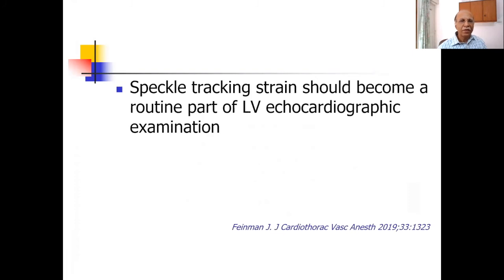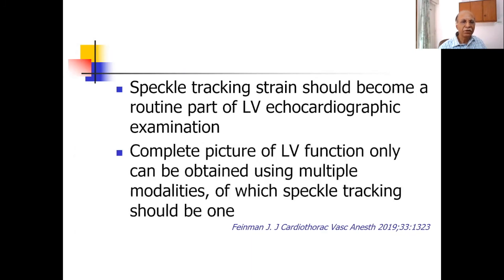Let's move on to the speckle tracking of the strain, which should become a routine part of the LV echocardiographic examination. It is suggested that a complete picture of LV function can only be obtained by using multiple modalities that we have discussed so far, of which speckle tracking should be one. So that's the importance of global longitudinal strain or speckle tracking.